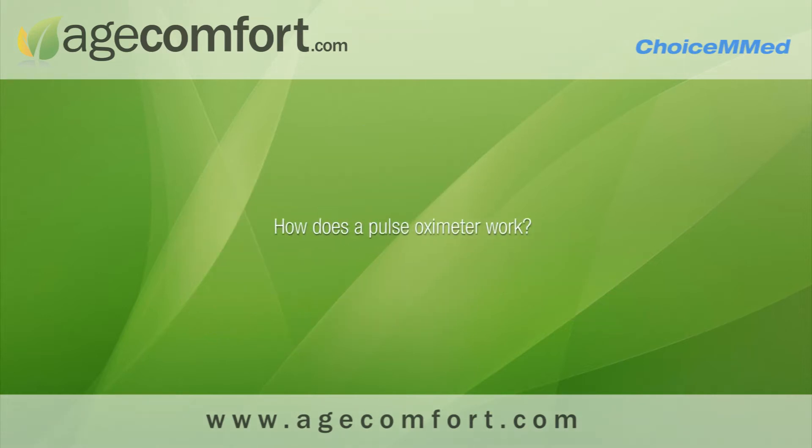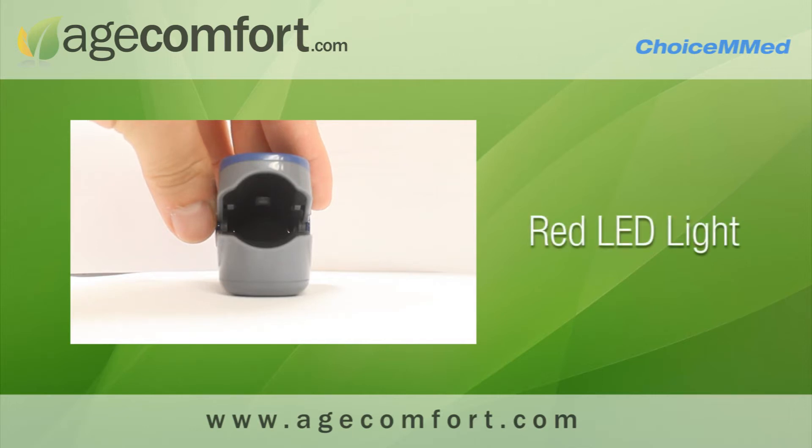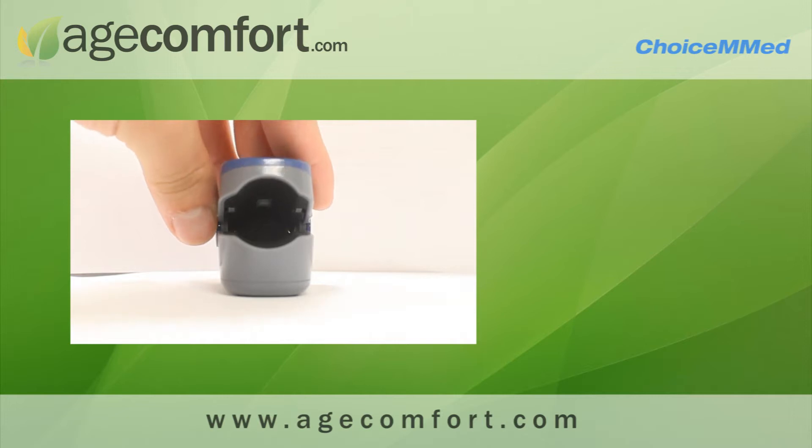How does a pulse oximeter work? When using the pulse oximeter, make sure that your finger lines up with the red LED light. This red LED light emits two wavelengths that reflect differently depending on the oxygenation of the blood cells.